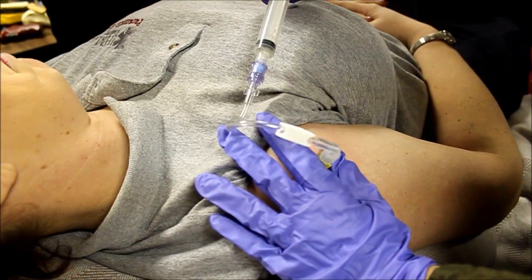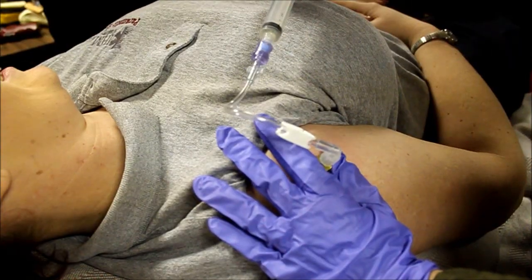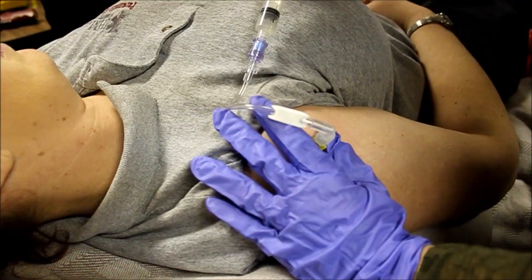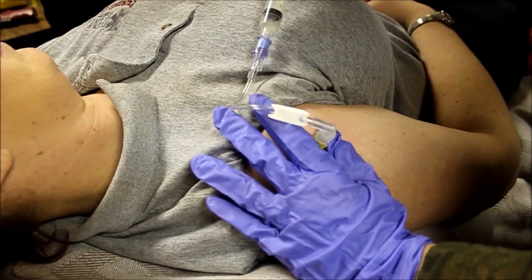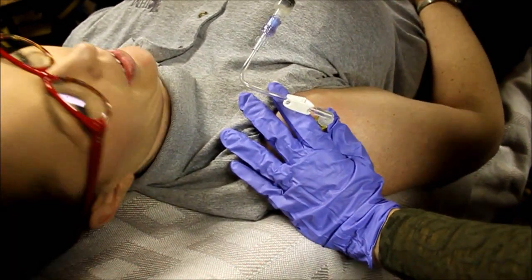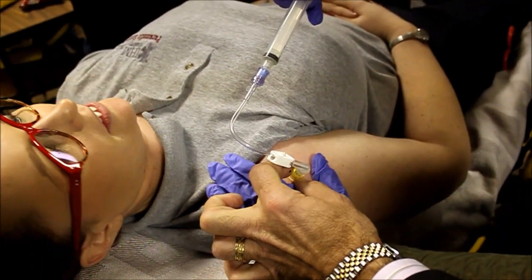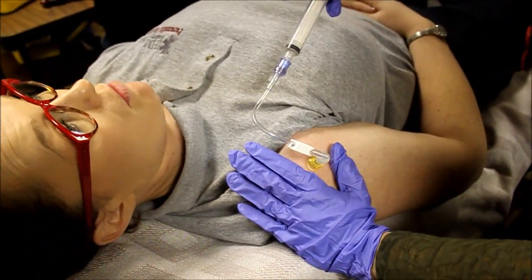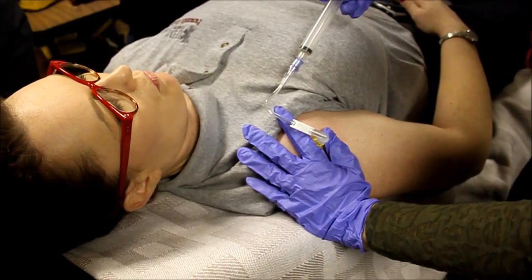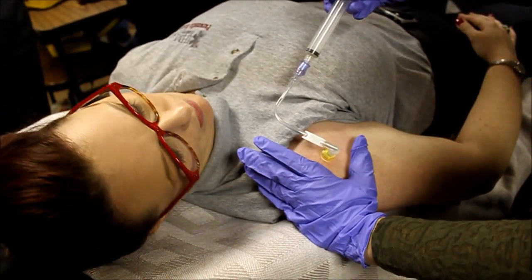Is that hard? Sometimes it feels weird, like a pulling sensation. Nope. She doesn't have any marrow. Looks like you're in the right spot. I felt it. Yeah, you're in. She's like quit shaking it. You might have hit up against that shelf — sometimes you get the epiphyseal plate. Awesome. Good job.